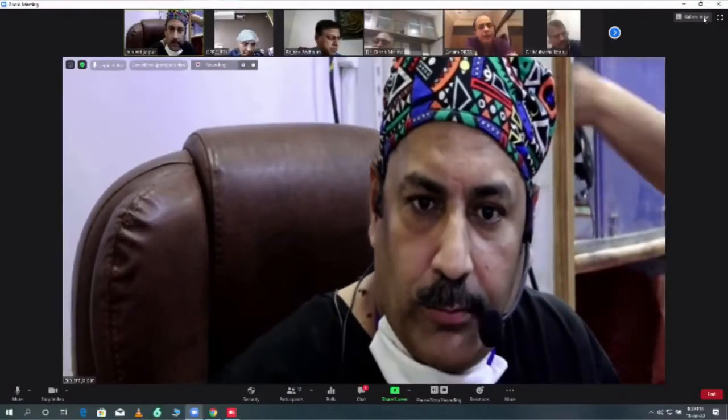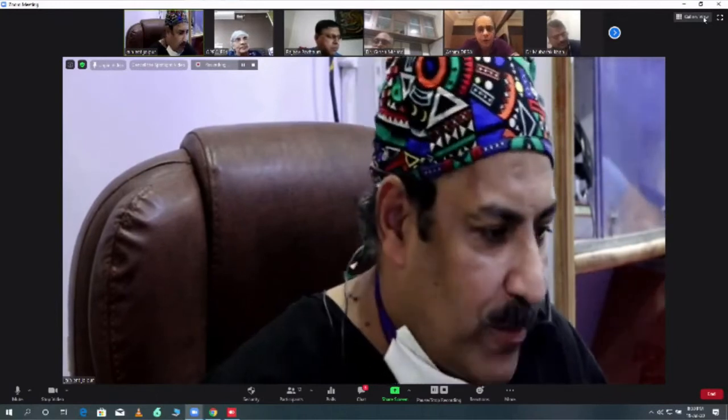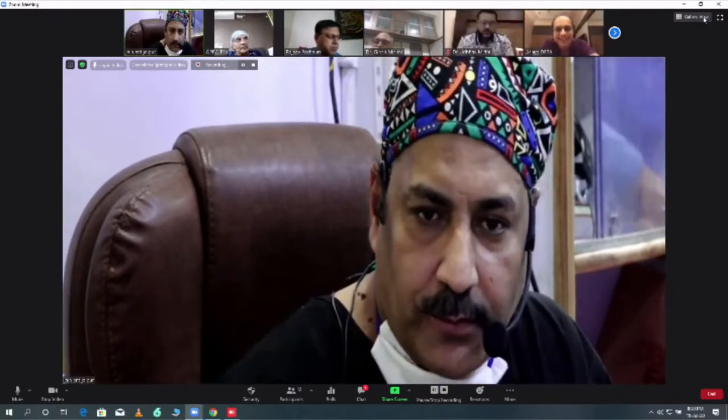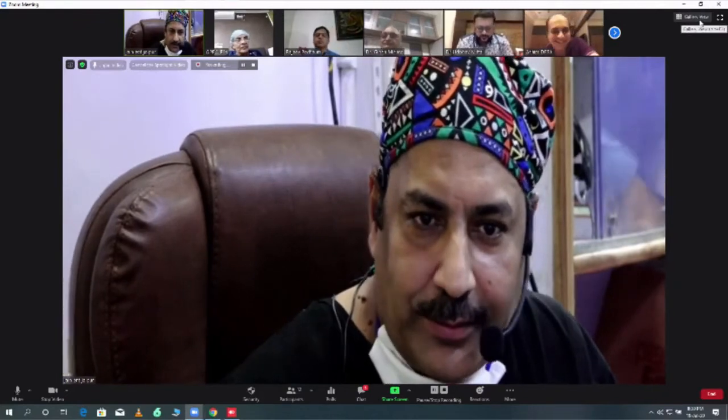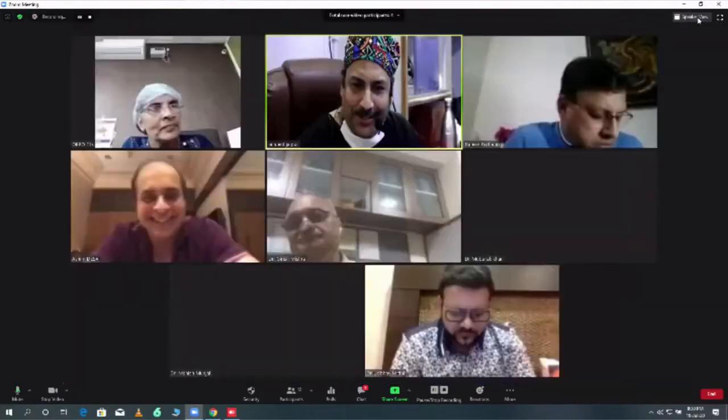No, boss, whatever you're doing is perfect. There's nothing to doubt about what you're doing. It's absolutely fantastic. We have our own philosophy regarding vein. That's a different story. It is institute-based.